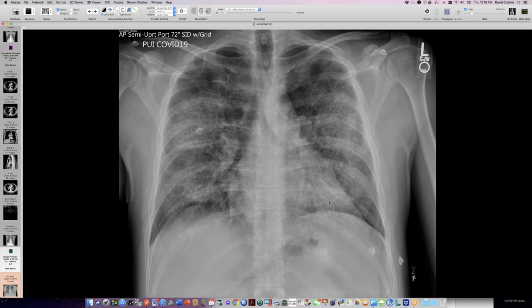So let me show you this young man. This is a case I've been puzzling over. I was asked to look at this case. This is a roughly 38-year-old man, fairly young, who doesn't have any bad habits and has this diffuse lung disease. This is January, and his history is that he was put on Humira for what was thought to be maybe ankylosing spondylitis, but the serologies were a bit ambiguous.